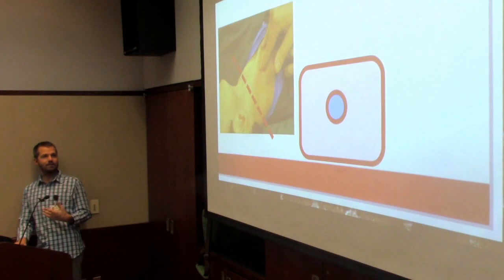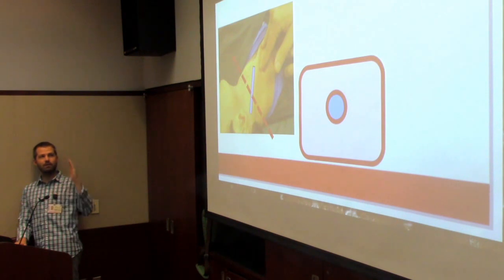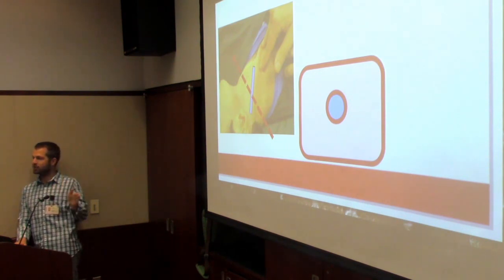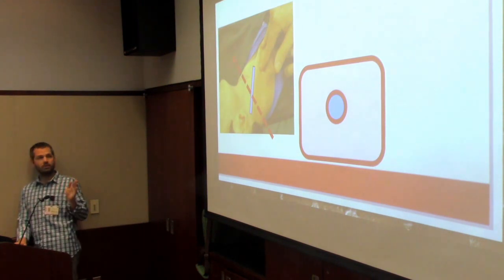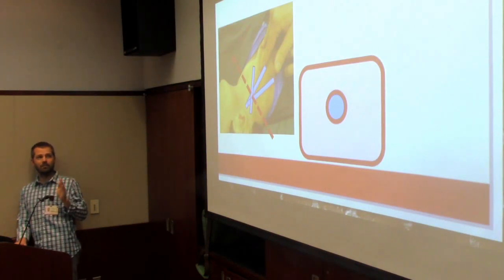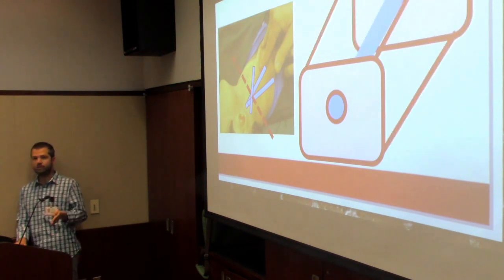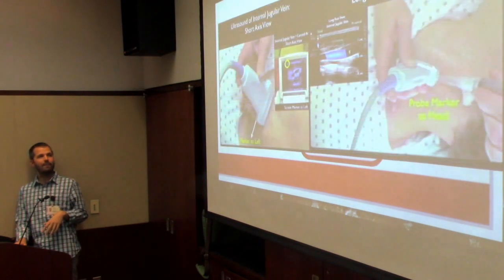So say this guy has a blood vessel. We want to stick some needles into it. You can't just think about that one tube. You've got to imagine its directionality. Those textbooks are great. They show you a tube, but you don't know what direction the tube is going. It could be there, it could be this way, it could be over there. How you set up and where you're thinking about pointing the needle will depend on the three dimensions, the actual direction the tube is going. This is also true with ABGs. You can't just feel one point. Sometimes you have to know a direction you're going. Or for an IV, you have to know the direction the vessel is going, even if it's just by palpation, so that you're not likely to hit a turn, and not likely to punch through the back side of it. You just got to think about these.